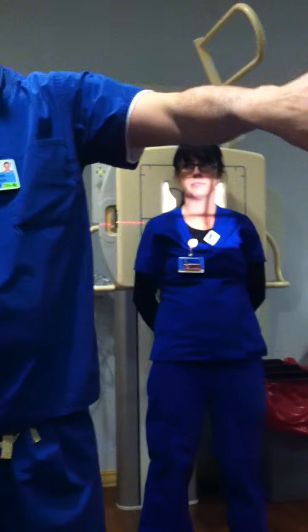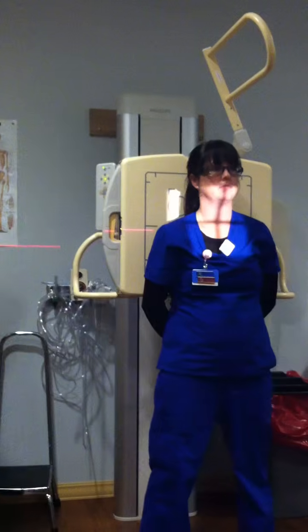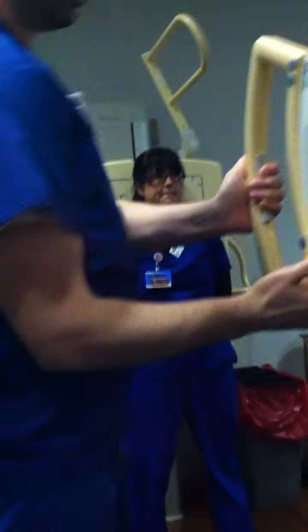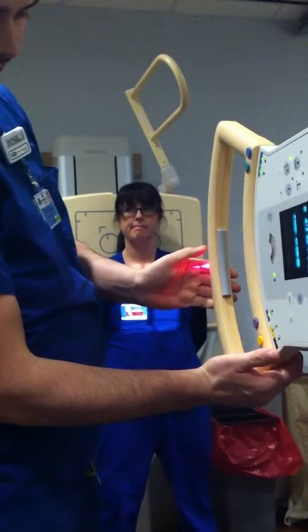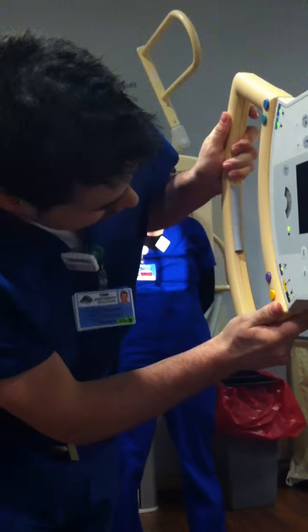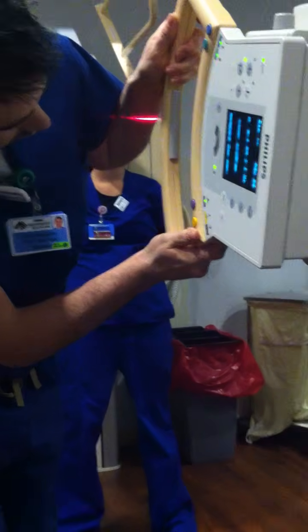Does it say 70 or 60 to 72? Oh, it says 60, doesn't it? I think it's a 60 to 72. So again, if you did your lateral at 72, you kind of want to keep it uniform. Because with obliques, you are rotating them up, so you do have an increased OID. Yeah, 60 to 72.